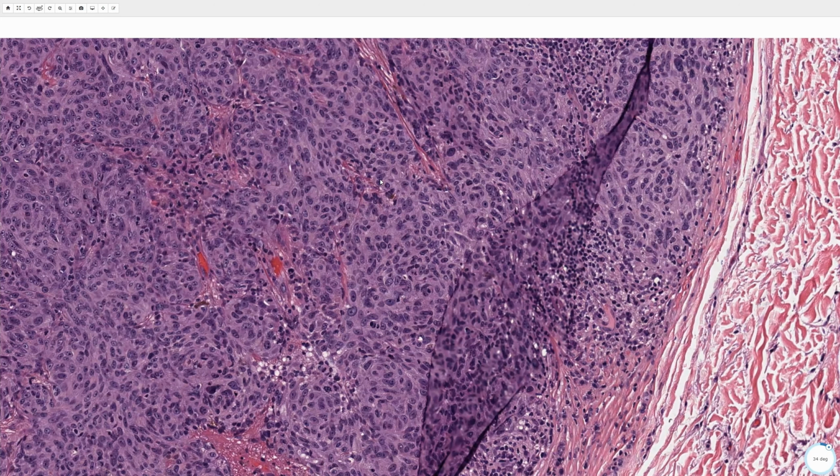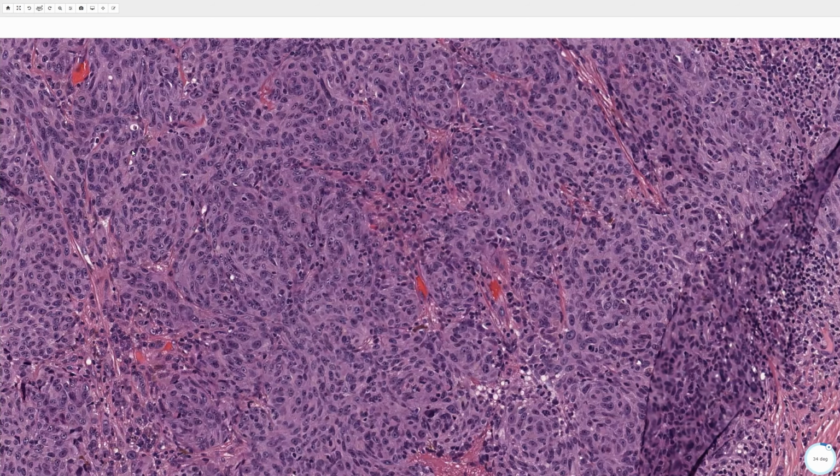And depending on the clinical setting, sometimes these less well differentiated tumors can lose their typical labeling with other melanocytic markers. So Melan A and HMB45 or other stains that are going to target pre-melanosomes may not stain as prominently, especially as the tumor loses its pigment. So if you're using one of those more specific markers, it may not label as well as the tumor becomes more dedifferentiated in a metastatic lesion.